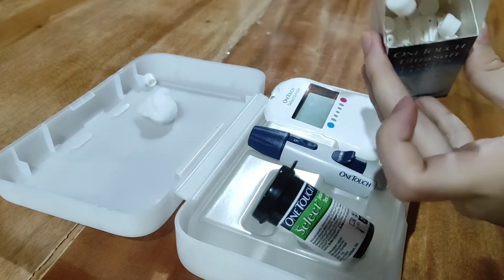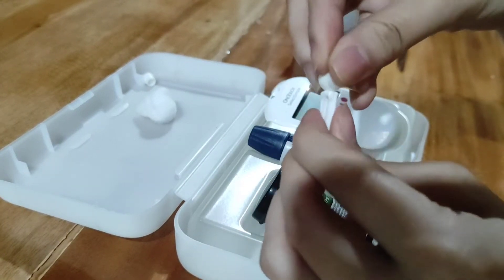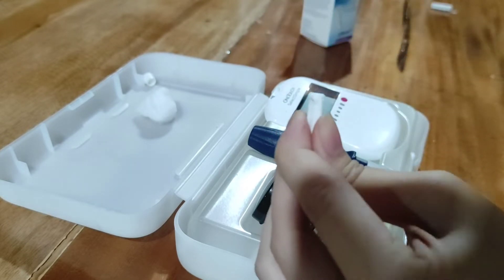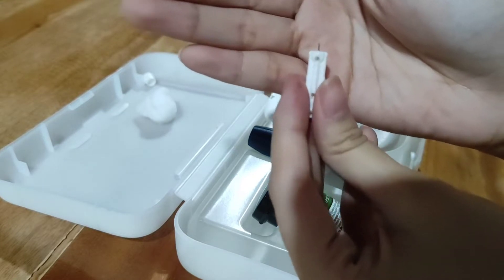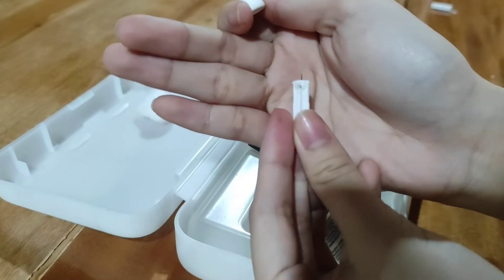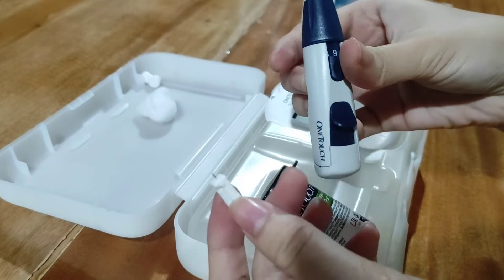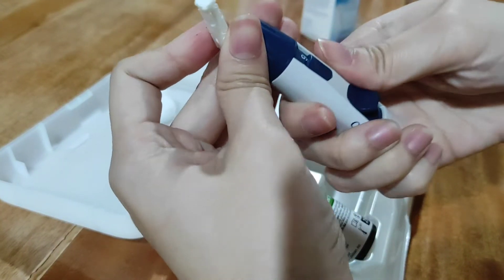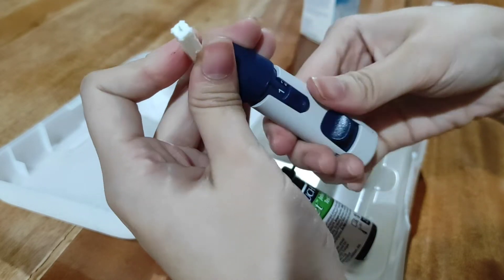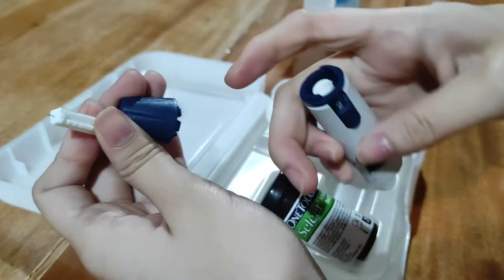Kukuha tayo ng lancet, and then in opening this one, we're just going to turn the head of this one and then pull. As you can see, yan ay yung matulis na port. And then i-attach natin sa lancet device natin. In opening the lancet device, open natin yan and then pull.